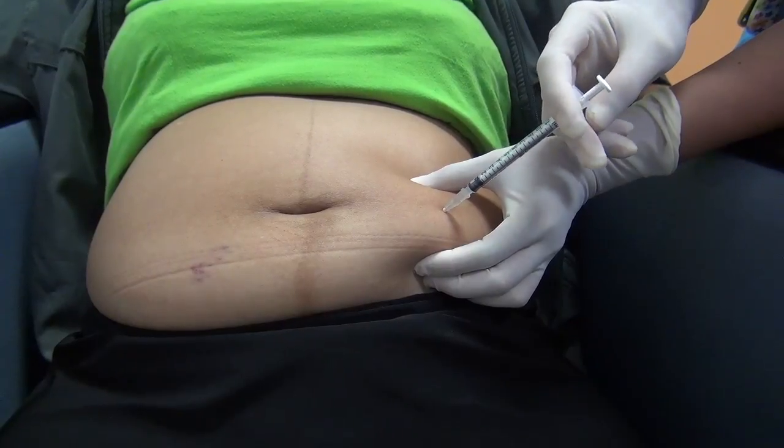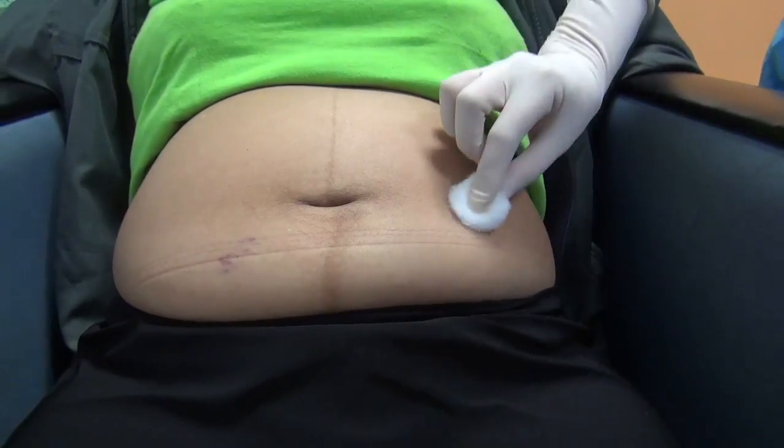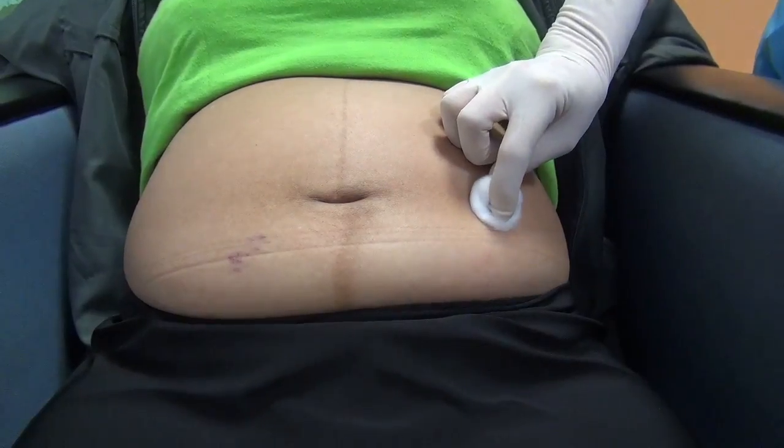Then, withdraw the needle and dispose of it into the sharps bin. Check the area of injection for any signs of active bleeding. It is preferable to have different areas for each injection.